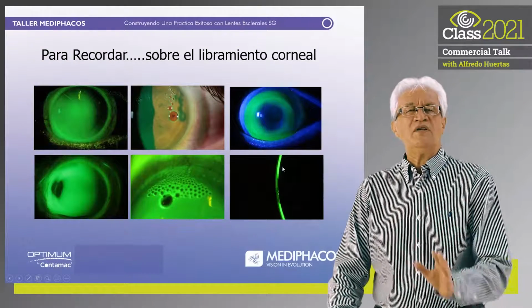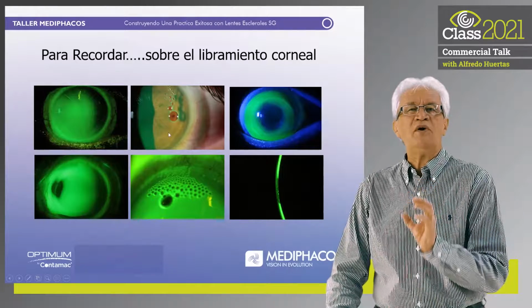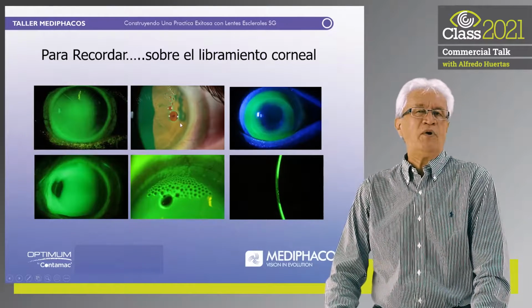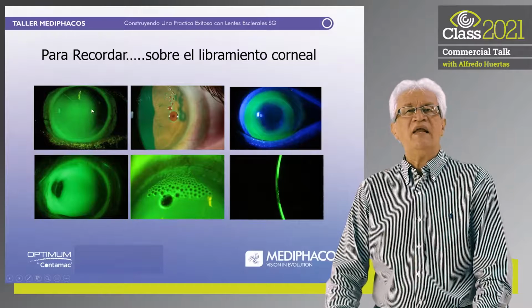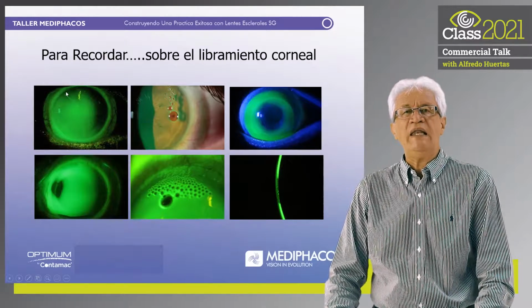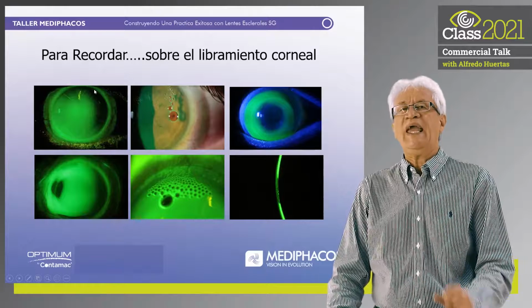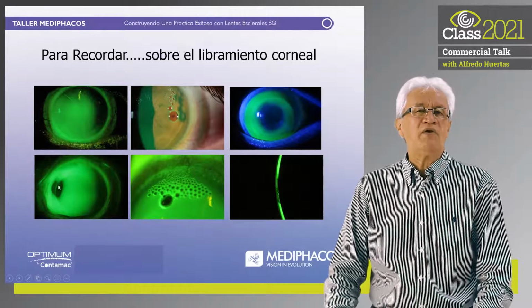If we remember some types of situations when we are making a contact lens adaptation, this type of situation should not happen. And if we appreciate the arrow and then see that the dark area from 0 degrees to 135 degrees in the limbar area, there is a touch, and in the other quadrant, from about 300 degrees to 360 degrees, there is a touch. This situation cannot exist. Now, if you look in the image below, the same case is occurring, but with more hours of use, we see another touch.